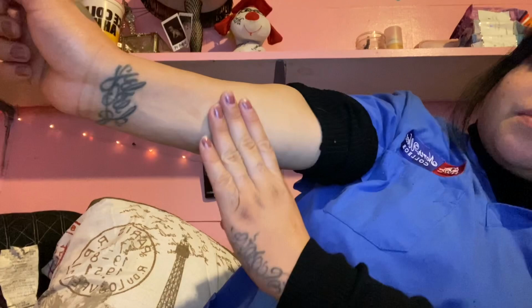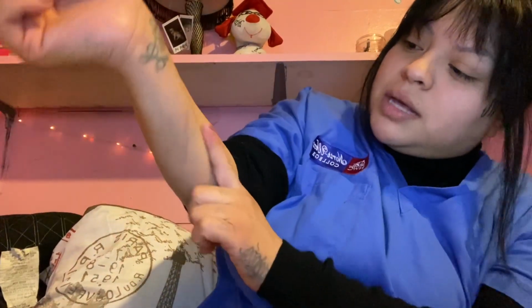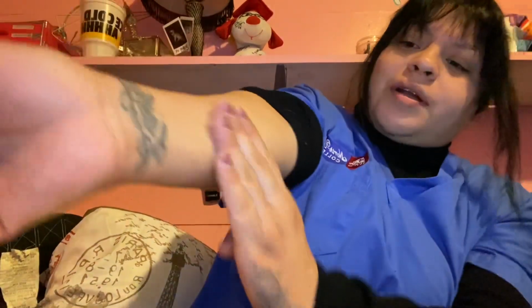So if I were to put my hand, it would be somewhere around here, like towards the middle. I think somewhere around here. In the mid anterior aspect of the forearm. Mid anterior. That's where you will be injecting the patient. You want to avoid any scars or any discolored pigmented areas. After that, you want to loosen the needle cover.